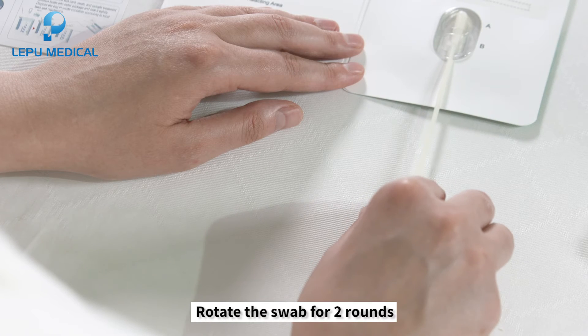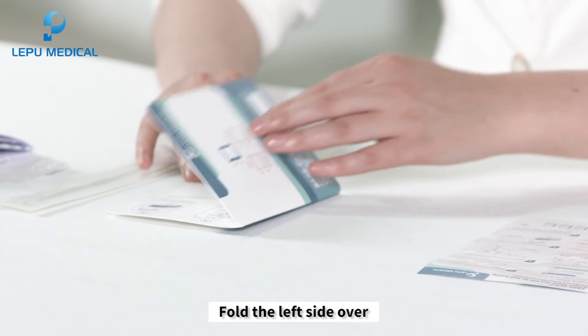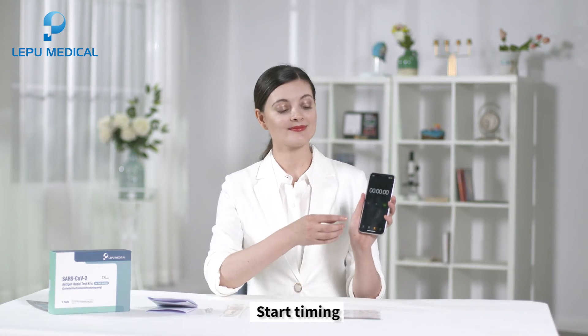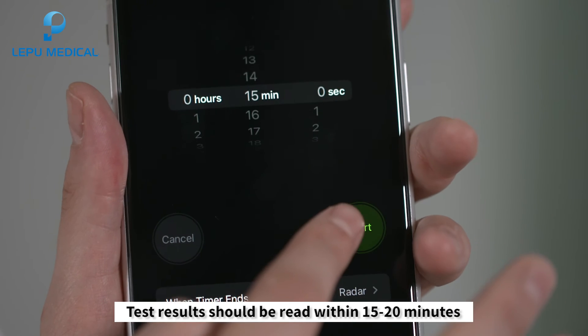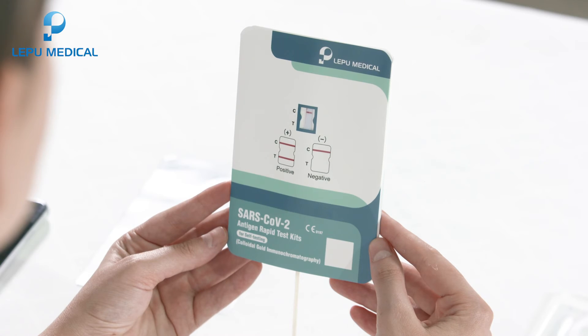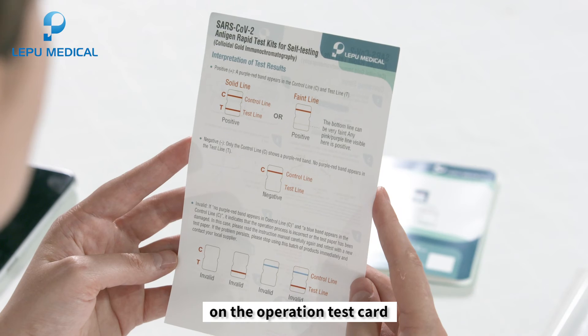Rotate the swab for two rounds in each direction in the buffer. Fold the left side over and fit the two sides together completely. Start timing and wait for the appearance of a purple-red line. Test results should be read within 15 to 20 minutes.